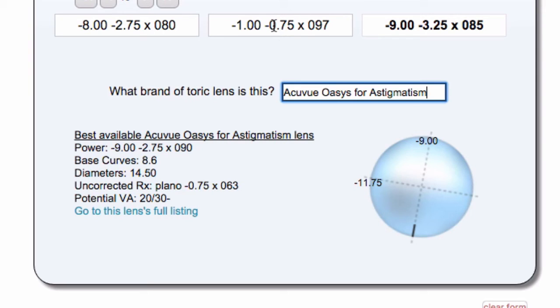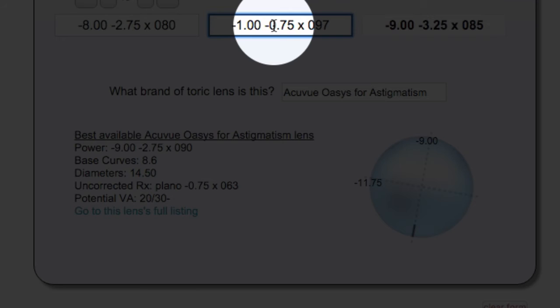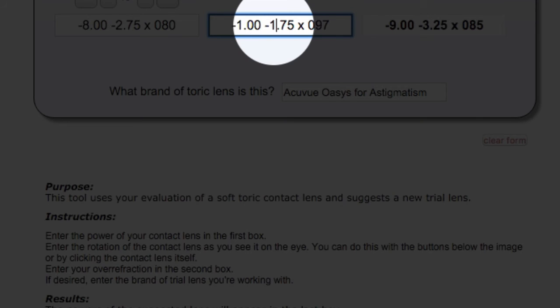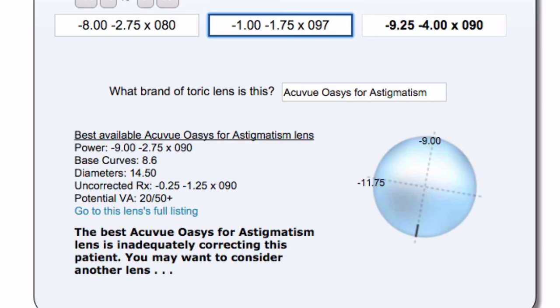If it's leaving more uncorrected prescription, for example, if I made this 1.75, there's more uncorrected astigmatism. The best vision is more in the 20/50 range. And it gives you some advice - the best lens in this brand seems to be a little inadequate correcting the vision, and you might want to consider another lens.